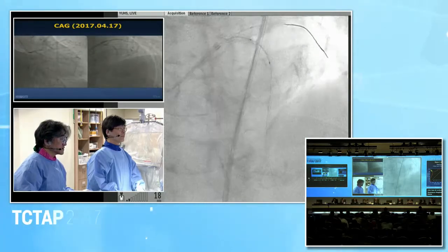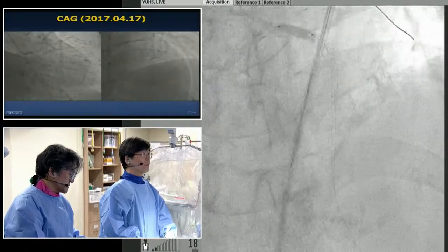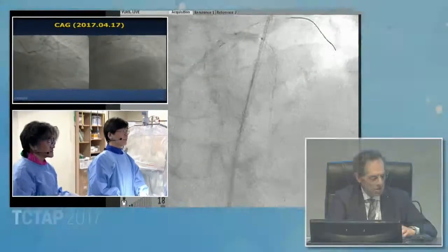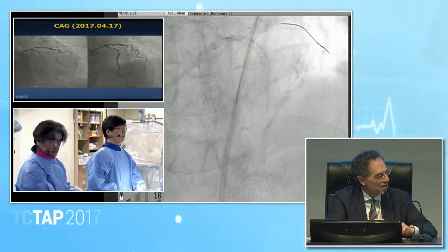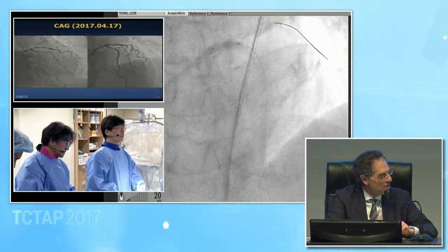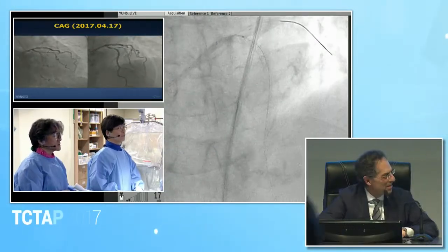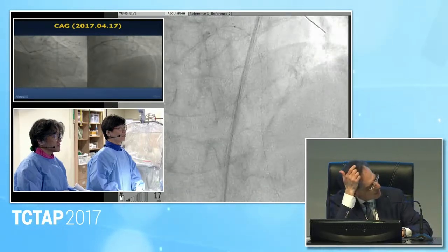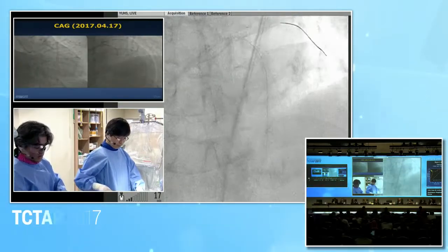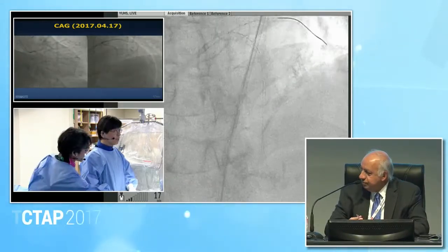Stop just before rupture. Go ahead. I wanted to go back to the story of the ostium, to be very precise, because in fact there are data showing that in one quarter of the patients, when we want to reach the ostium, we are missing the ostium. So I think it's not so crucial if there is not a huge pathology around. The question is, is it essential to cover the ostium in every left main, mid part, distal left main? If you're not reaching the ostium, is it mandatory to cover the ostium? Because it does not seem so based upon the data.